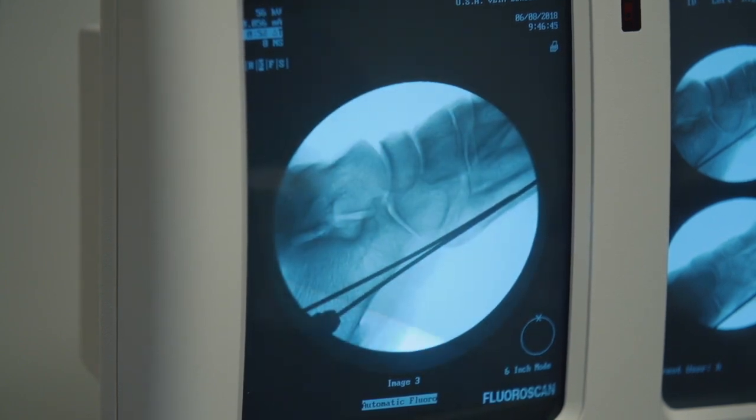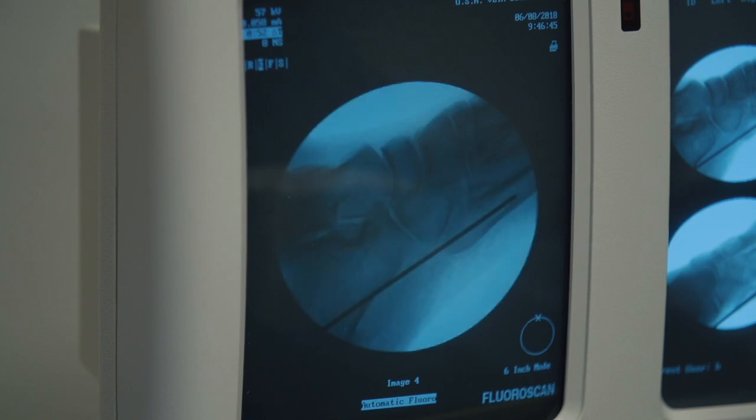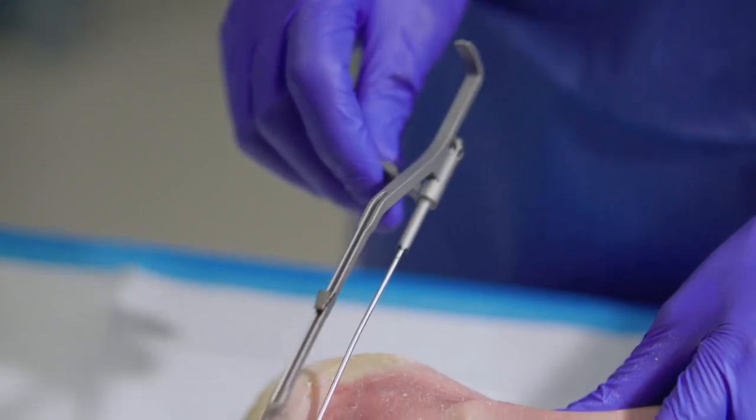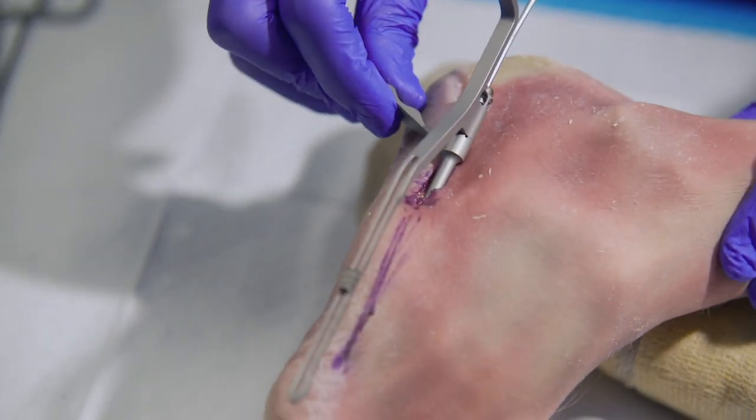So now we can remove the first wire. And you'll see that our placement of the second wire by utilizing the parallel positioning guide is more optimal.